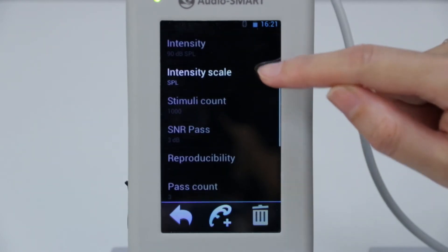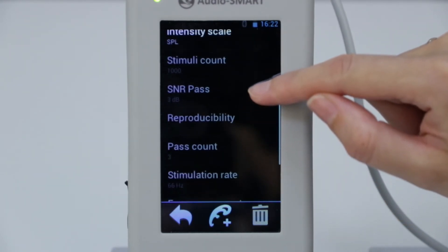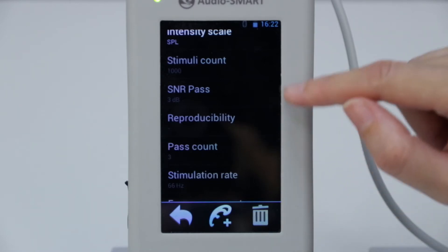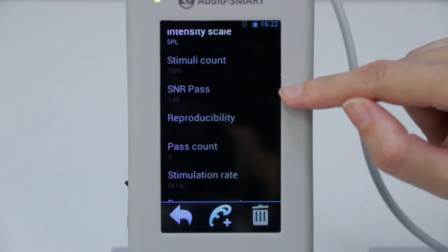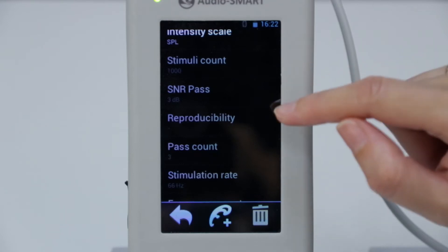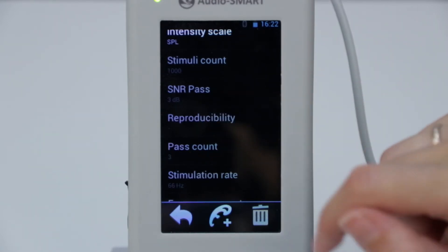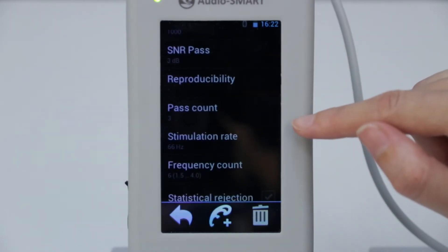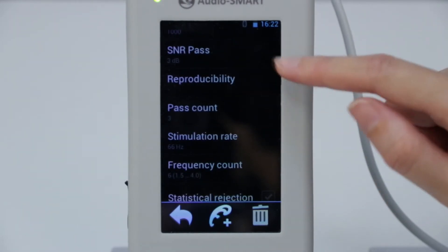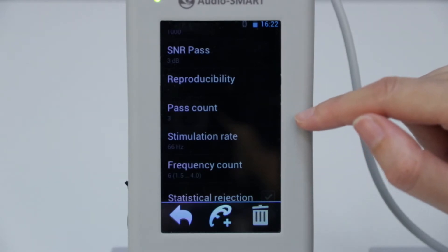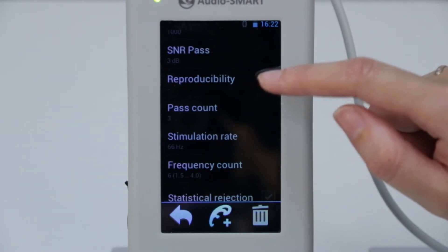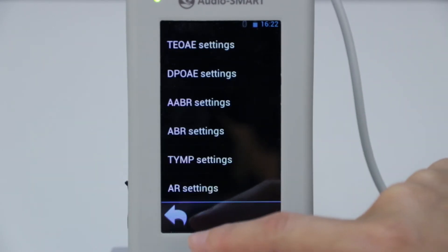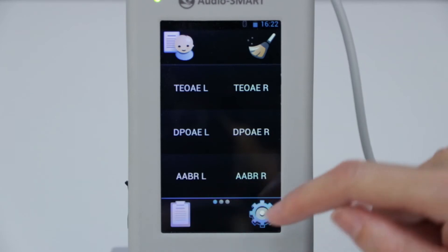Let's see the parameters of this template. We see that the signal-to-noise ratio for pass is 3 decibels and that we need to get this result in 50% of frequency bands, 3 of 6. Go to the main menu.